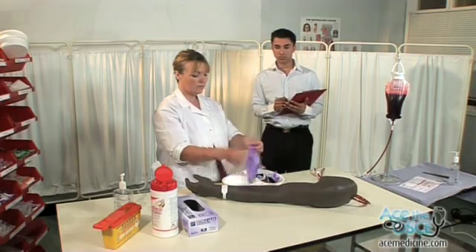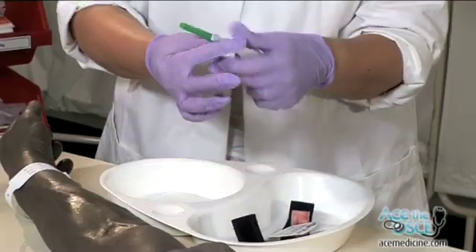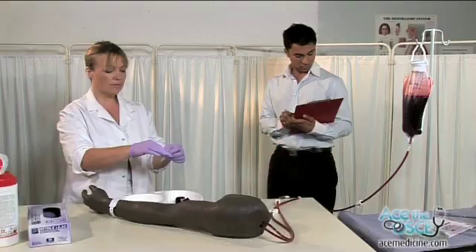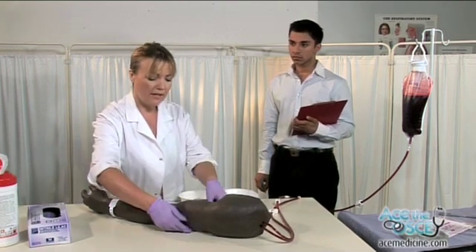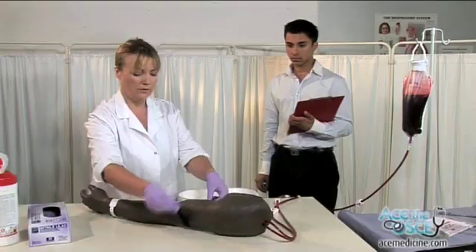Put on gloves. Attach the Vacutainer needle to the barrel. This may feel a little tight. Apply the tourniquet two fingers above the antecubital fossa.